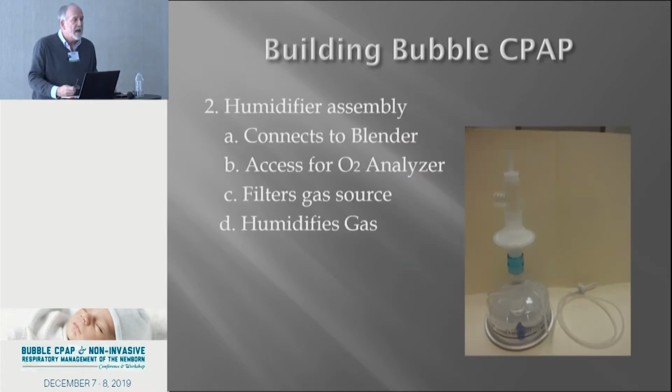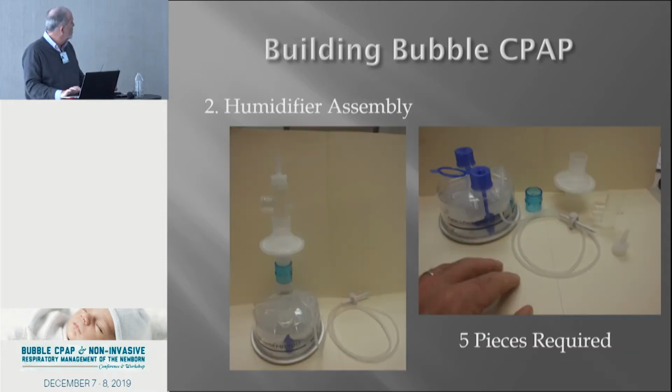A heater assembly to add humidity. The gas comes out of the wall, zero humidity and cold. Not the best of either situation for our babies. So we're going to humidify it, warm it up, okay? The humidifier assembly has these pieces. We'll go through how to put them together. I narrowed it down to 5 pieces.